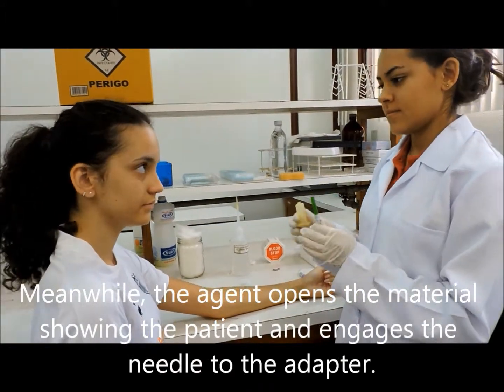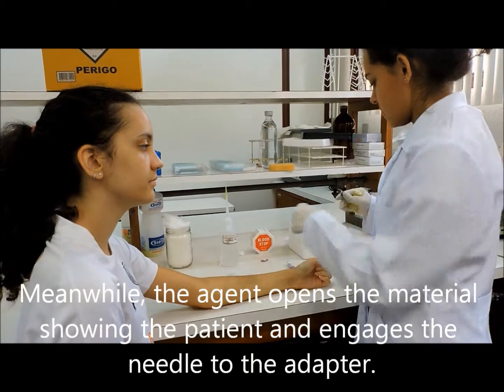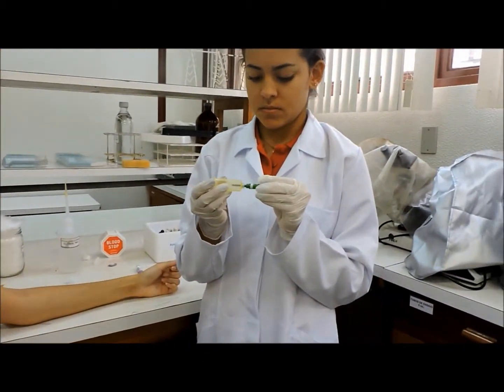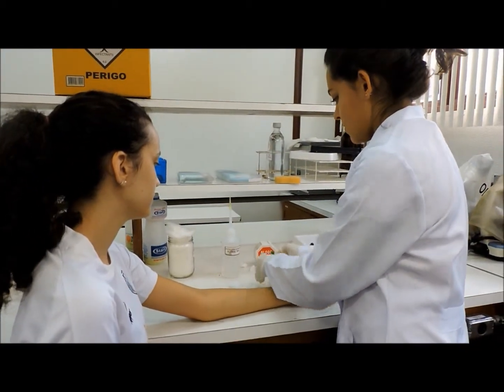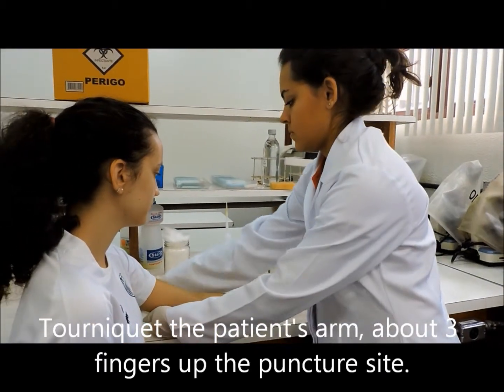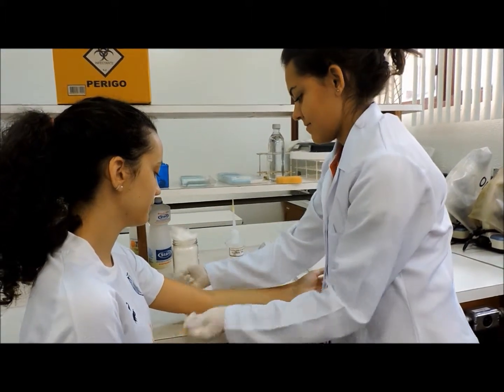Meanwhile, the agent opens the material, showing it to the patient, and attaches the needle to the adapter. Tie the tourniquet on the patient's arm about 3 fingers above the puncture site.